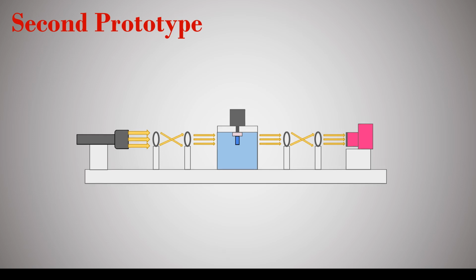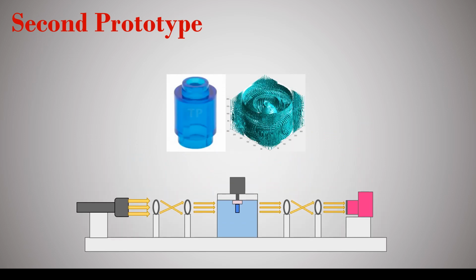So the issue with this is that it ended up having way too much noise, and that would be because the alignment wasn't correct with the 3D printer or the cheap lenses and container, which could have had impurities. But the most important takeaway is that the MATLAB code was combined into one. So a push of the button would take the image, rotate the object, and process the data into models that you can see before you.